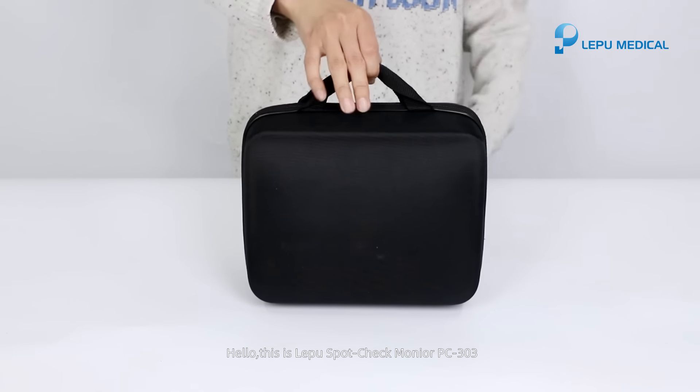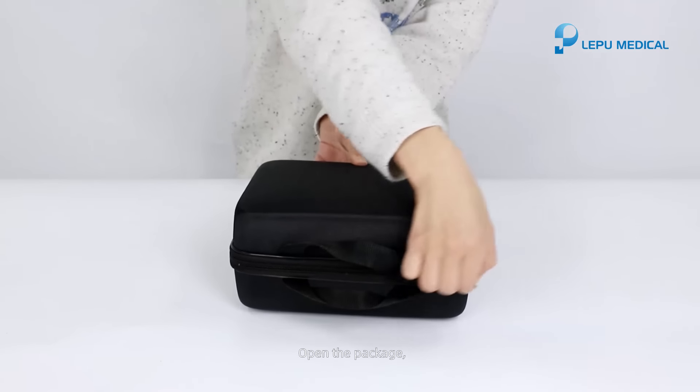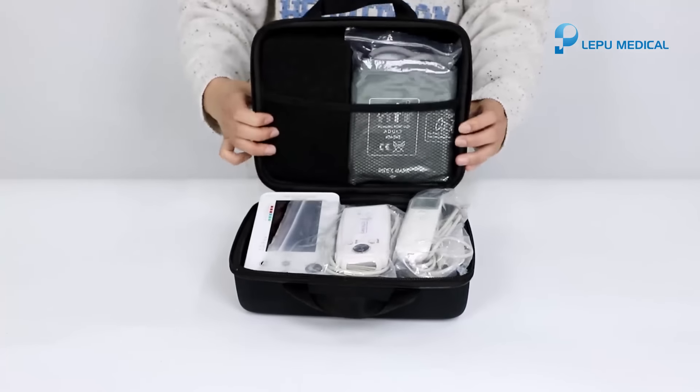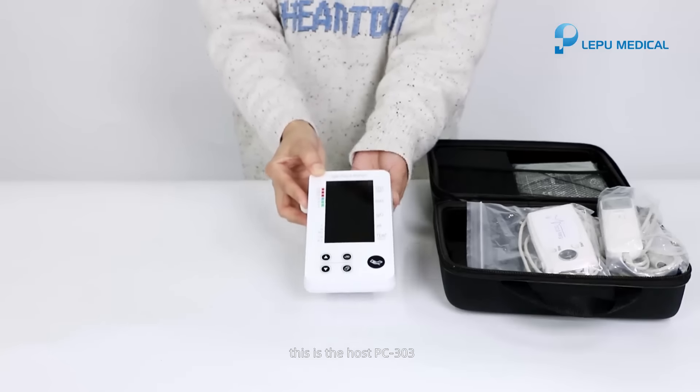Hello, this is the LepaSpotCheck Moneyer PC-303. Opening the package. This is the host PC-303.